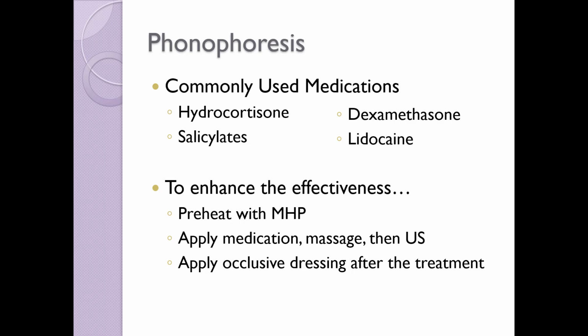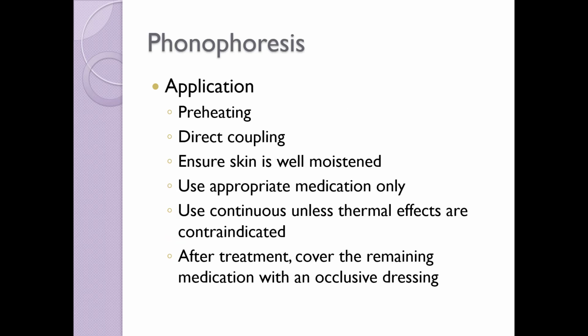And then performing ultrasound on top of the massaged medication. Or you could apply an occlusive dressing after the treatment in the hopes of holding the medication into the skin longer for further transmission. The application of phonophoresis should include the following steps. First, preheat the area with a moist heat pack for approximately 20 minutes. Then use a direct coupling method for the ultrasound treatment. Ensure that the skin is well moistened prior to treatment.